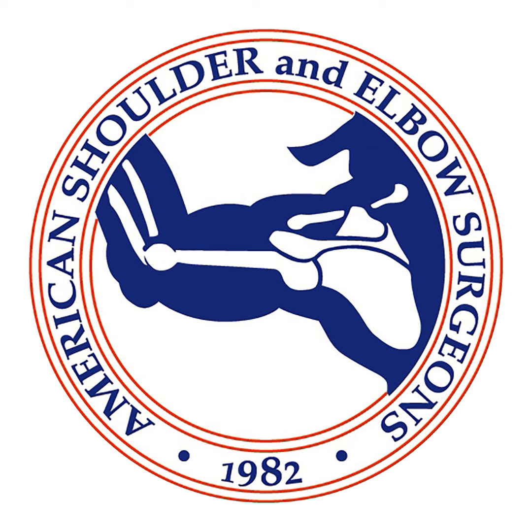for surgeons. If you're going to make this transition to stemless, if you're making a freehand cut, consider going back to using a cutting guide, whether it's IM or EM or whatever cutting guide you're using, to make sure that you feel a little more confident about the quality of reconstruction, because it's so important with stemless. The cut is so important.